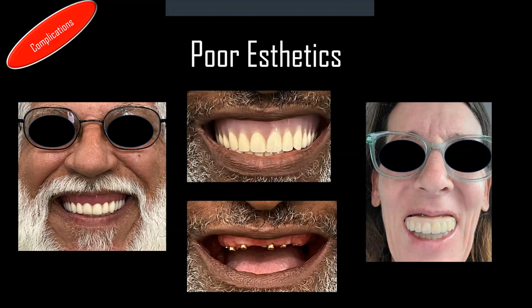These are all cases that presented to my office for an evaluation after their implant treatment and prosthetic treatment were completed, and at the end of the day, they just weren't happy with what they were given. As I mentioned, patients are coming to us for their final restoration.